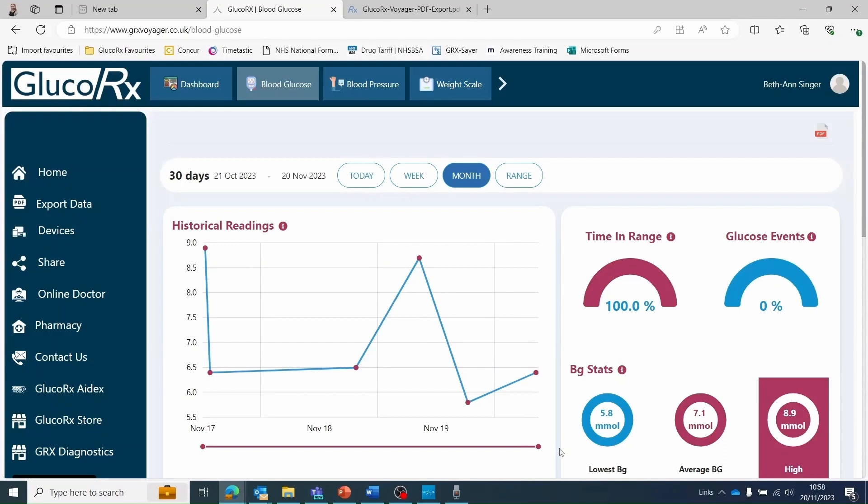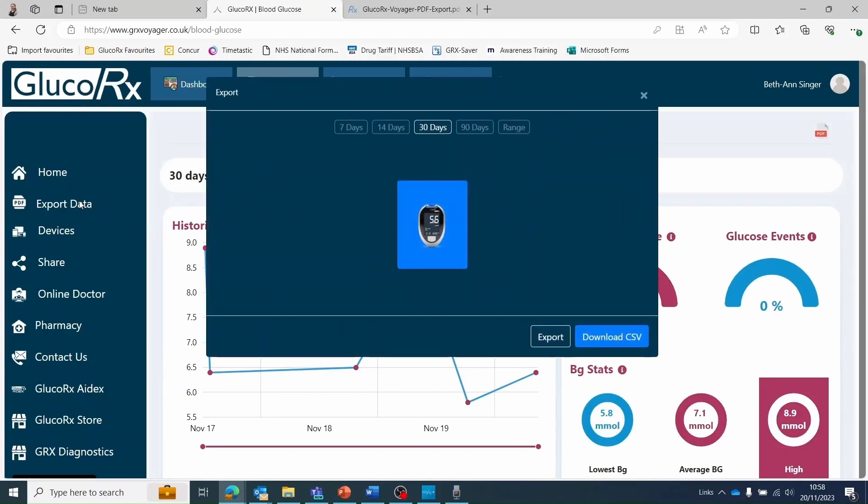You can export your data by selecting export data on the sidebar. This will prompt you to select the date range you wish to export, for example 30 days, the GlucoRx meter which you have uploaded the readings from, and the report you wish to generate.